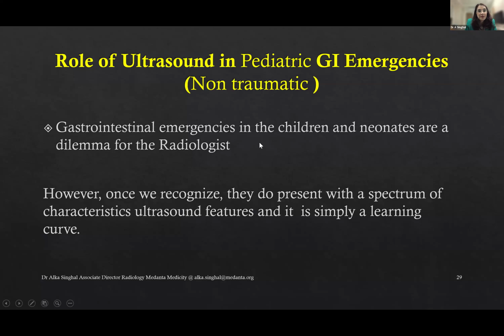Thank you. So GI emergencies in children and neonates are a dilemma for a radiologist. You would all agree, yes? The child can't communicate where the pain is, we do not know what the pain area is, the child may be conscious, non-conscious, not responding, sleeping, crying, various challenges, anxiety of parents, everything. Doctor, what to do? We can't do too much CT again and again. There is a pain, what to do, right? A lot is on the shoulders of the ultrasound and a lot is on the shoulders of the person who's holding the probe, right? So let's simplify it.